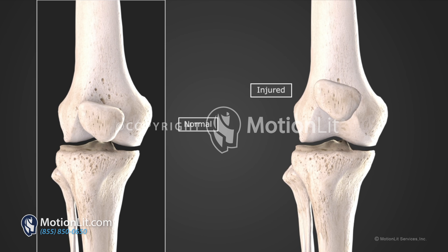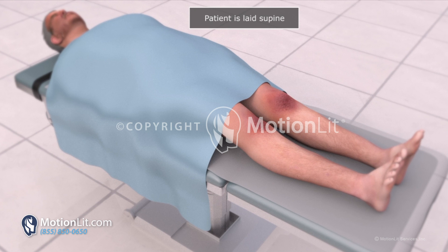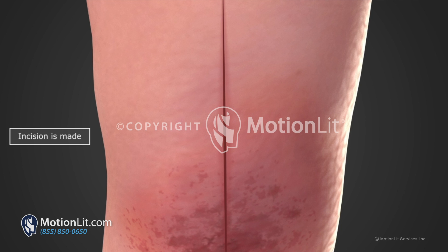Treatment for complete patellar tendon ruptures is surgery. The patient is brought into the operating room and laid supine on the back. Using a blade, a midline incision is created centered over the patella down to the tibial tuberosity.